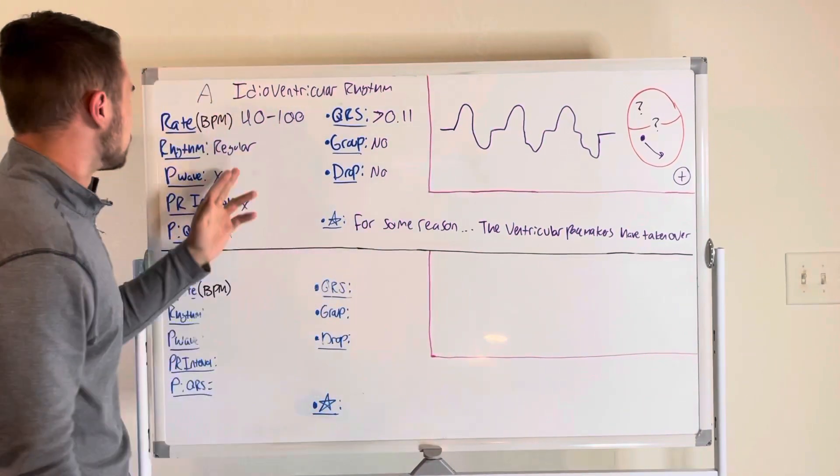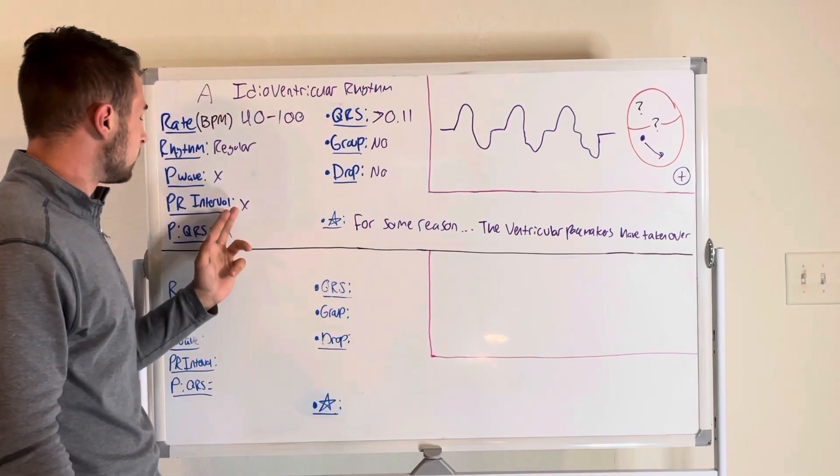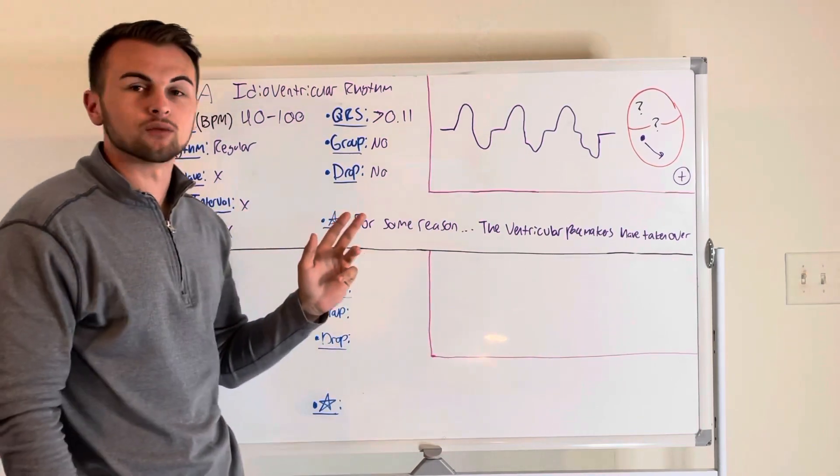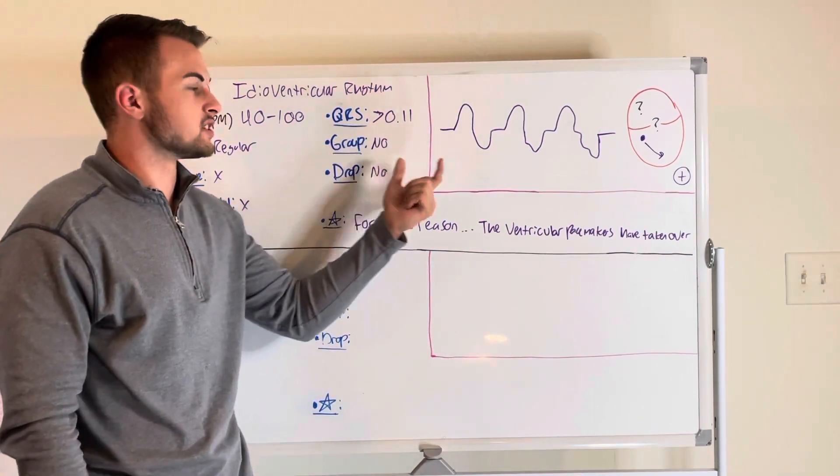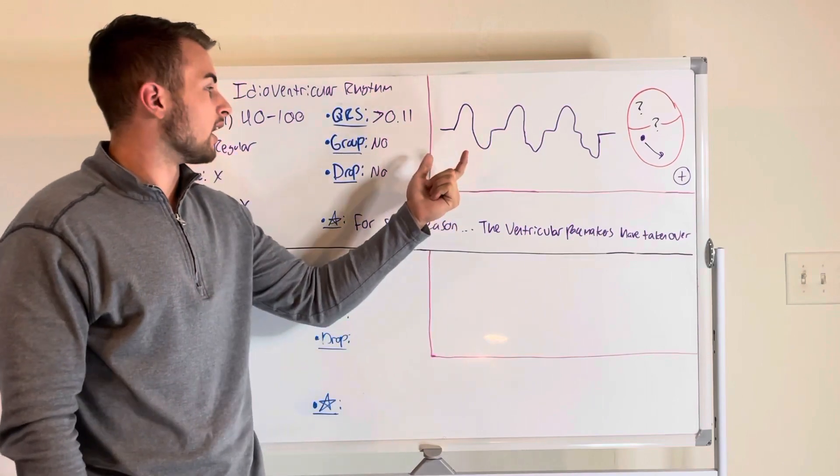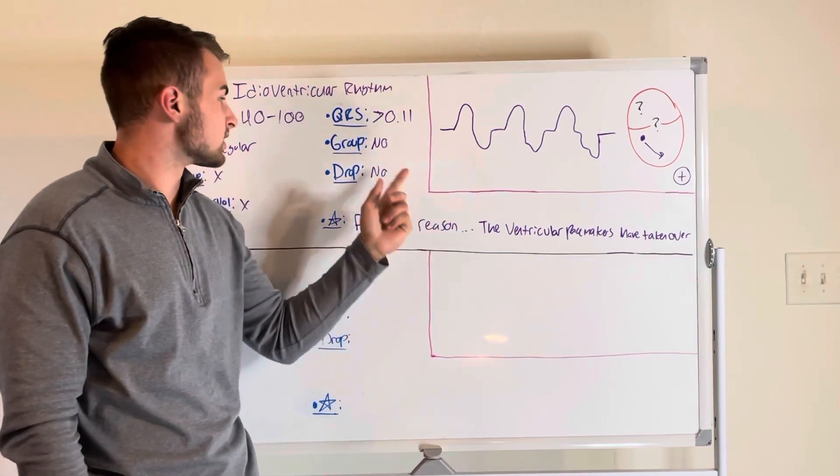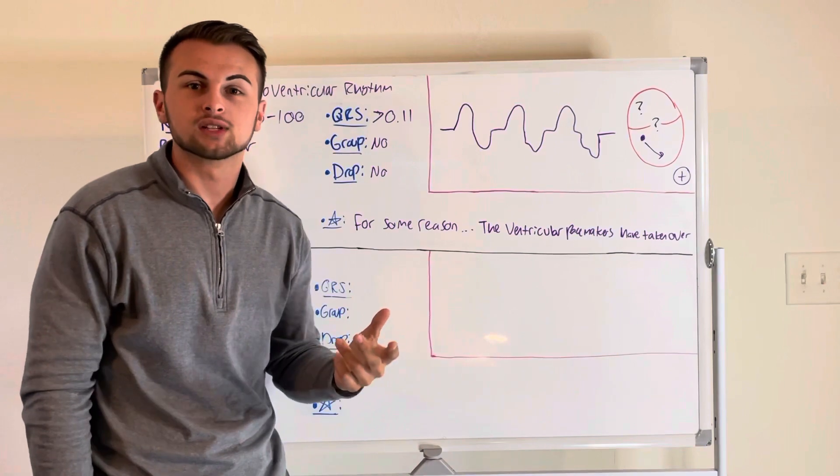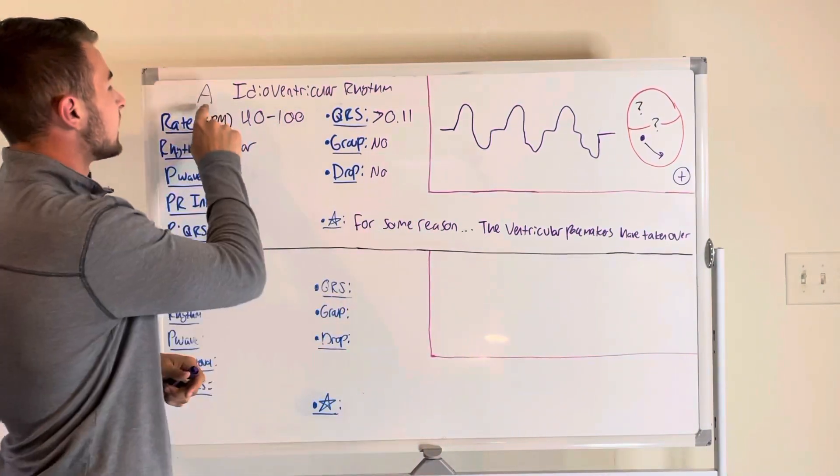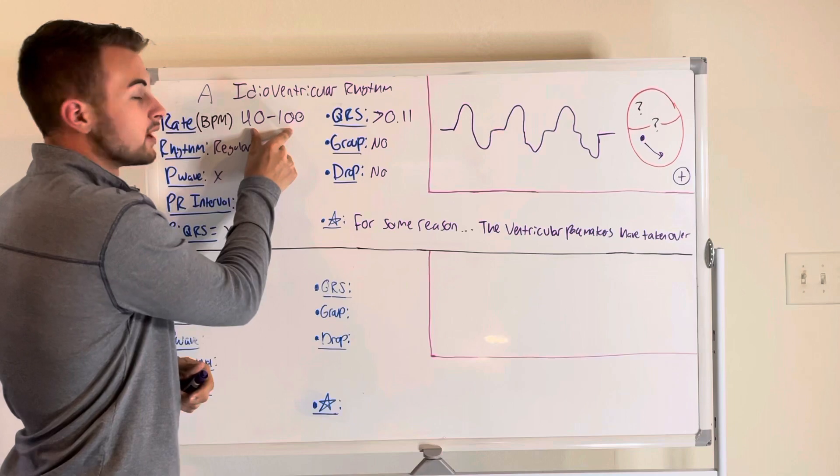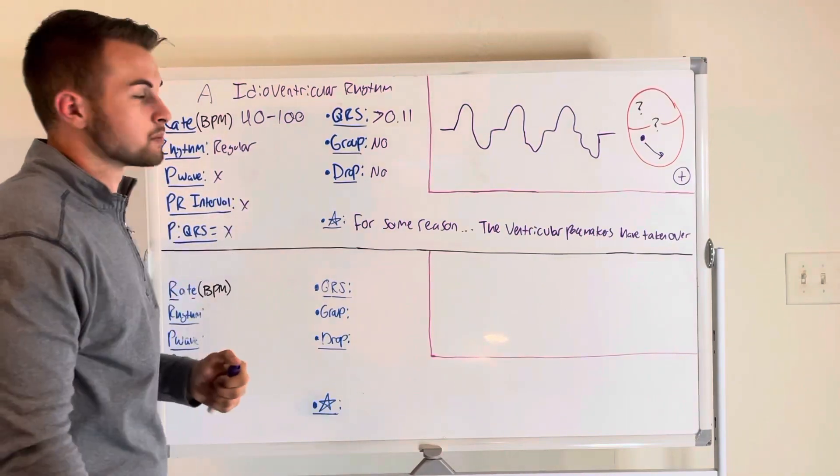Basically the rhythm is regular. There's no P wave, PR interval, or P to QRS ratio. The QRS is still wide and bizarre looking, greater than 0.11 seconds. There's no grouping and no drops. Literally the only thing that has changed is that it's accelerated to a rate of 40 to 100 beats per minute.